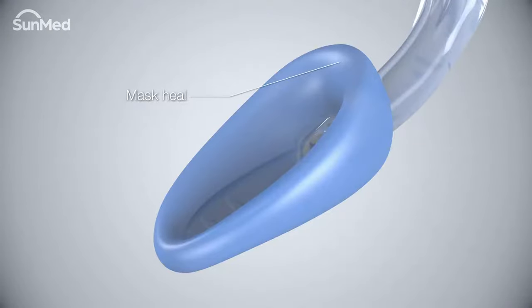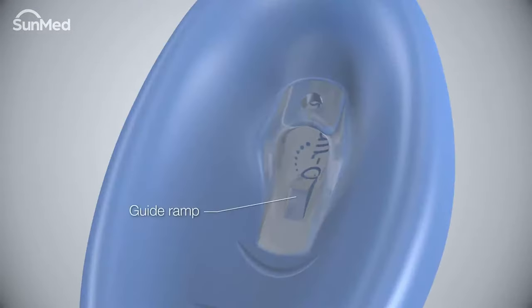The anatomical bowl and built-up mask heel improves mask placement and seal. The guide ramp helps to facilitate intubation and direct the endotracheal tube or scope toward the laryngeal inlet. The epiglottis elevator lifts the epiglottis and opens the airway for maximum access.